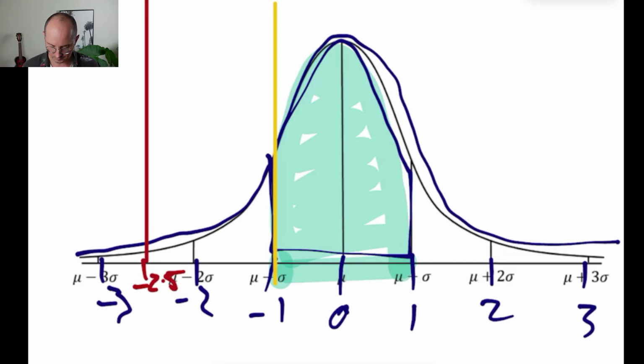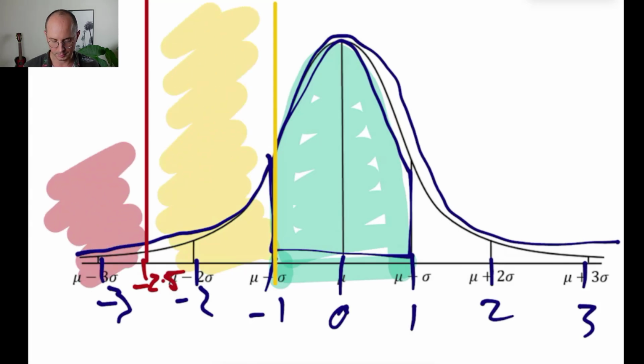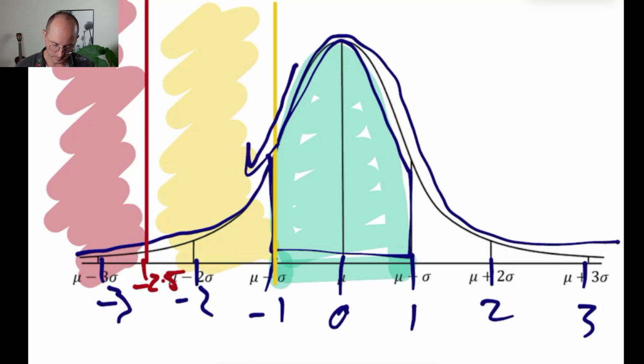So if we color these in, over here we've got osteopenia, and right here we've got osteoporosis. And as we go down this line, our bone density reduces, but also the number of men who have that T-score reduces as well, so the line goes down. This is what the numbers mean.